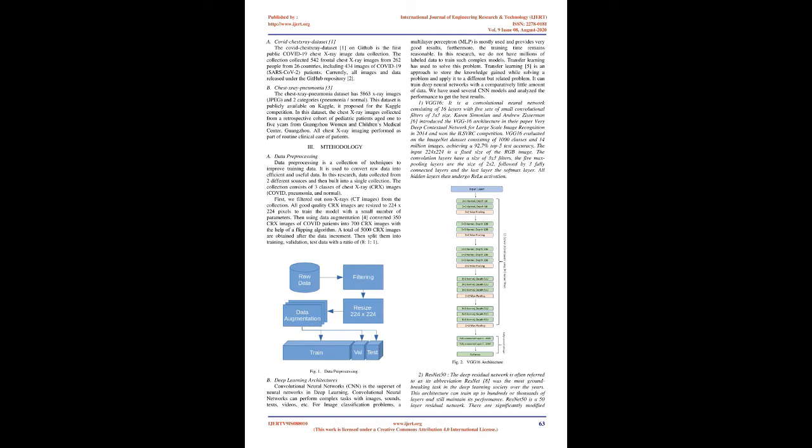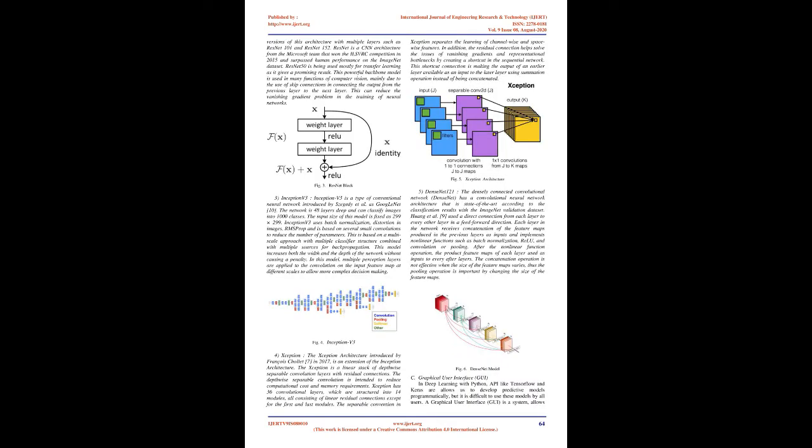After image data augmentation we get 5,000 chest X-ray images, including 700 COVID (350 before image data augmentation), 2,150 normal, and 2,150 of pneumonia patients' chest X-ray images. A. COVID chest X-ray dataset 1.